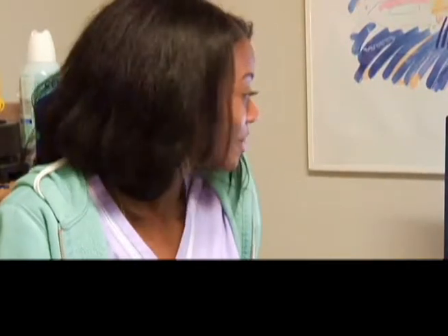Emily will be here for about 1 hour. She's basically just laying there for the most part, trying to be very still. She has eaten 2 hours before coming in as a prep. We have the patient change into a gown from the waist up. Typically we ask them to wear loose clothing, so now Emily's going to change into her gown and get prepped.